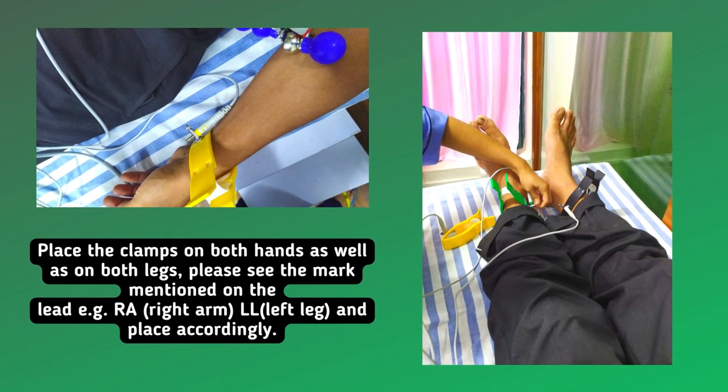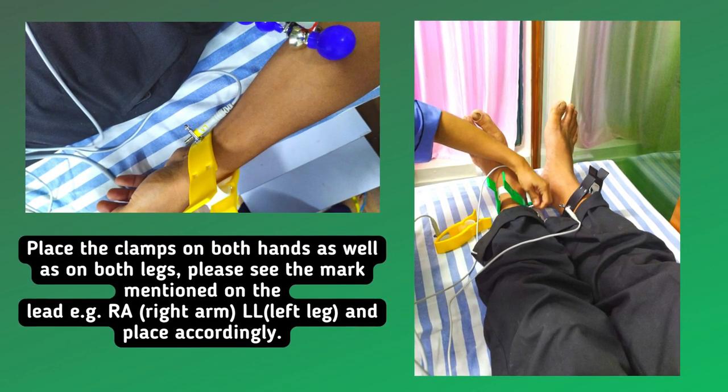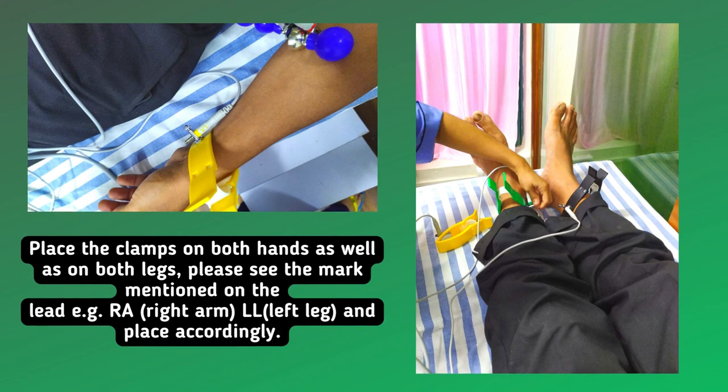Place the clamps on both hands as well as on both legs. Please see the mark mentioned on the lead — for example RA (Right Arm), LL (Left Leg) — and place accordingly.